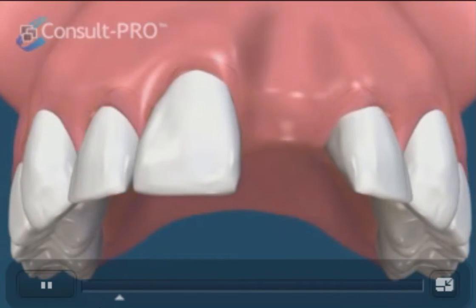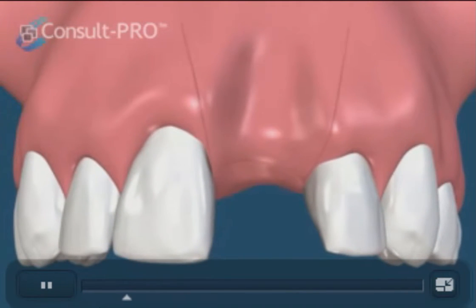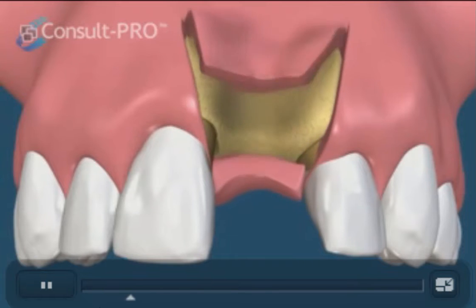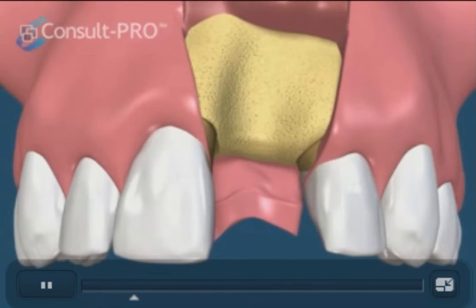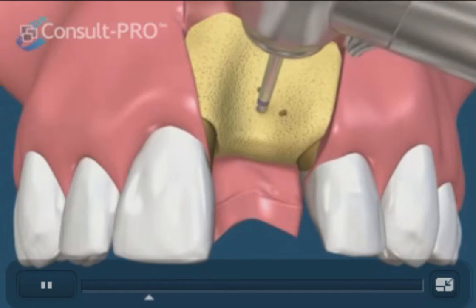We must now graft the area if we want to place an implant in its location. We start with flap retraction followed by decortification of the bone. These little holes will allow blood to reach the area more evenly and help with graft maturation.